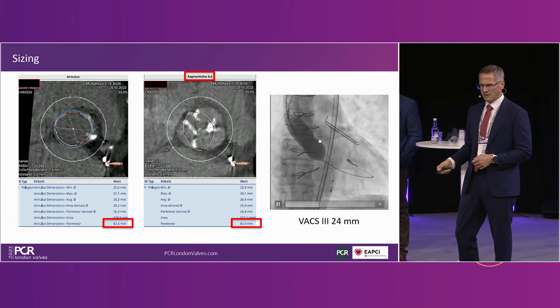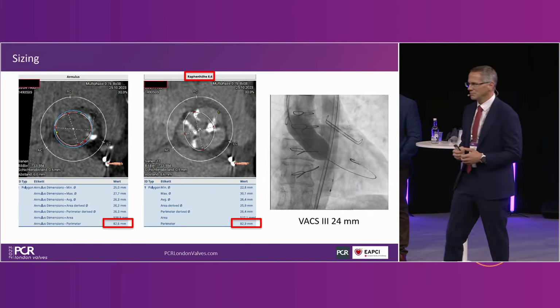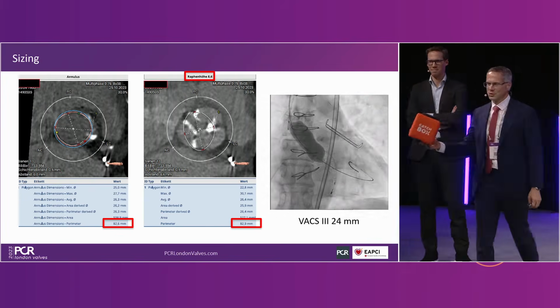And what we are able to see right here is that we see the raphe and the calcification. What do you think? Any rupture? It doesn't look like it moves a whole lot, right? So it was your suggestion. What do you think? So does it break? To me, it appears it does move. Actually, if I look at it, it does appear that it's going more vertical when the balloon is fully inflated.